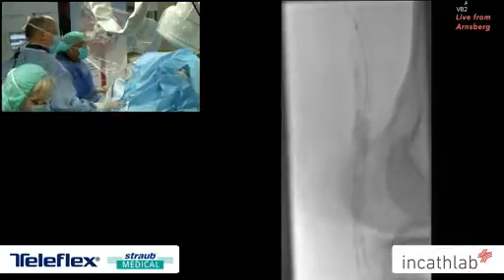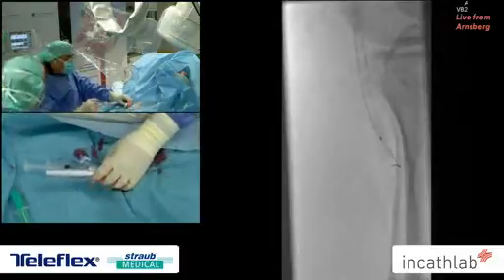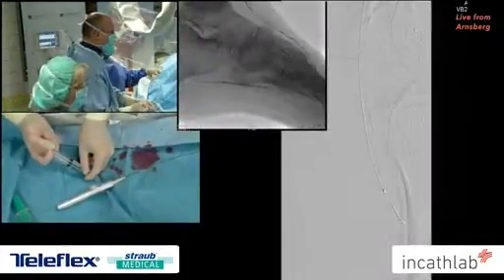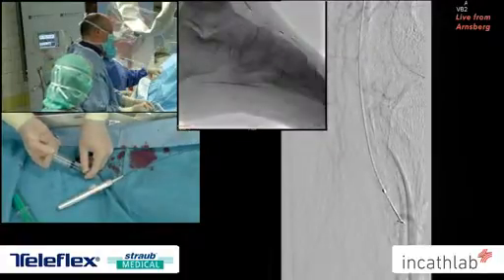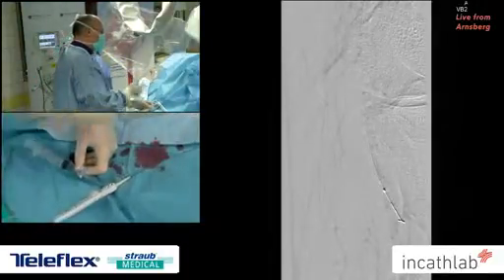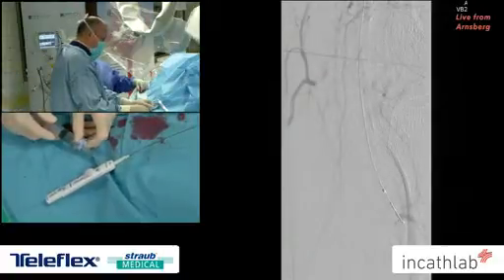So the problem is to have the two markers for the valve where we can inject the contrast medium. A few ml, 2 ml are enough, and we expect to see, as in the window, this kind of aspect. So we can really see through the occlusion. But it's important that the valve is in the occlusion, in the occluded tract, and in this case we had the markers very high.